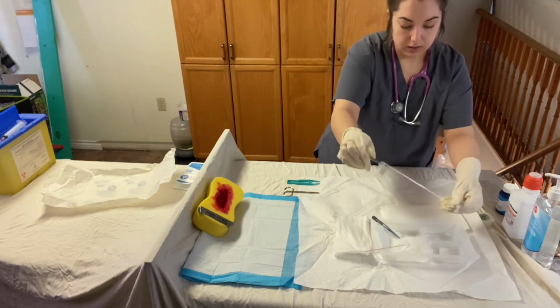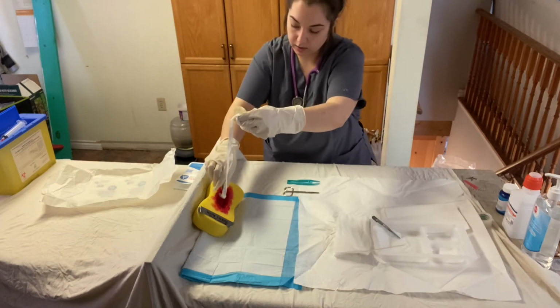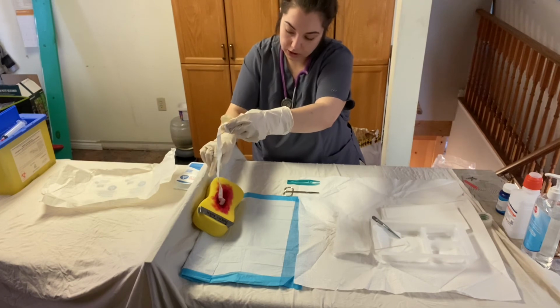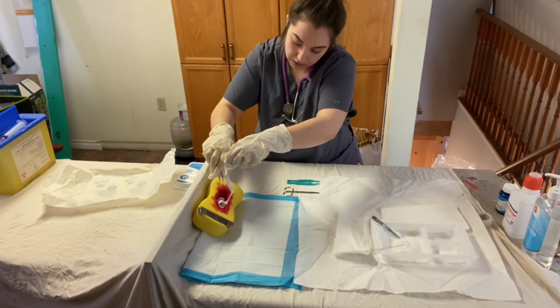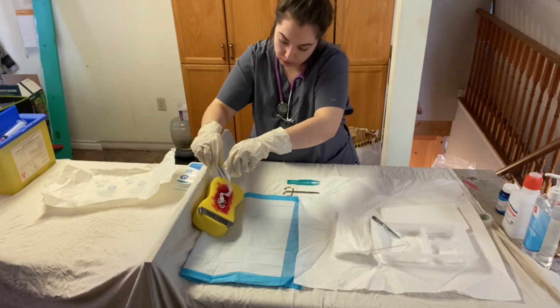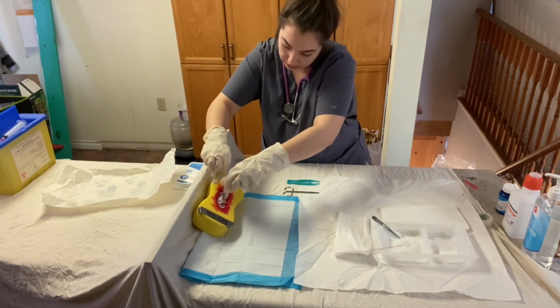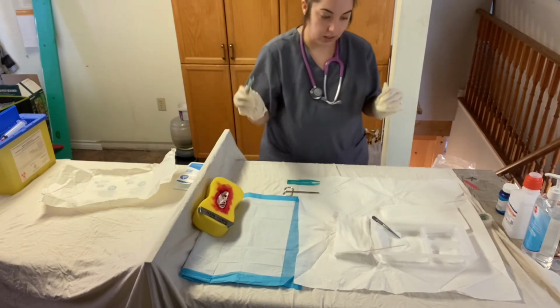And then what I'm going to do is I'm going to maintain sterility and just pack slowly without touching this on any of the wound edges at all, just taking my time, packing this in. I don't want it to be too tight, but I do want it to be a bit snug in there. Perfect. Maintaining a sterile field the whole time.